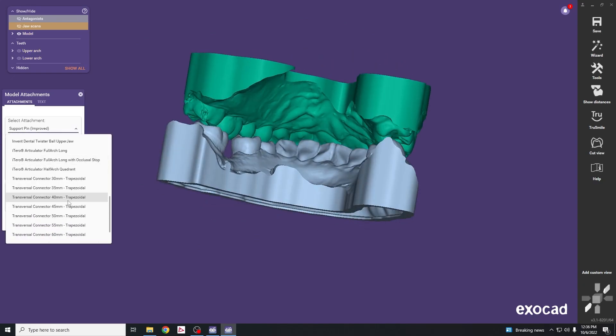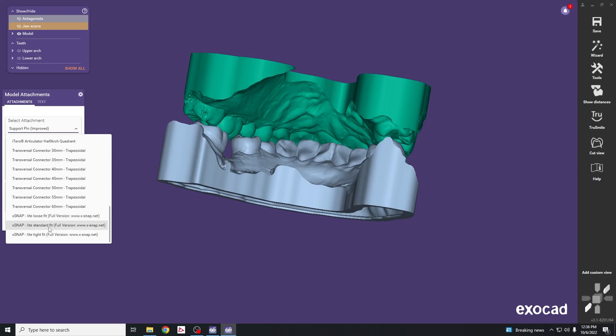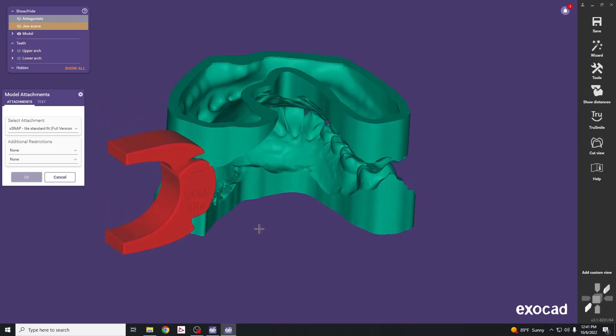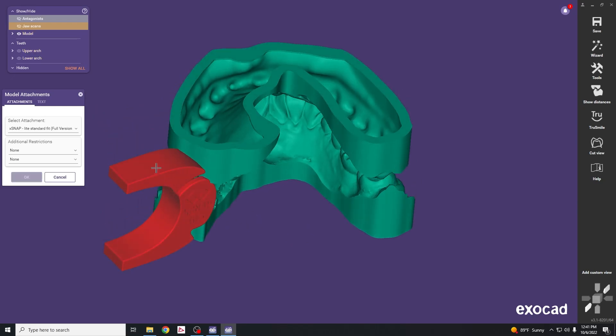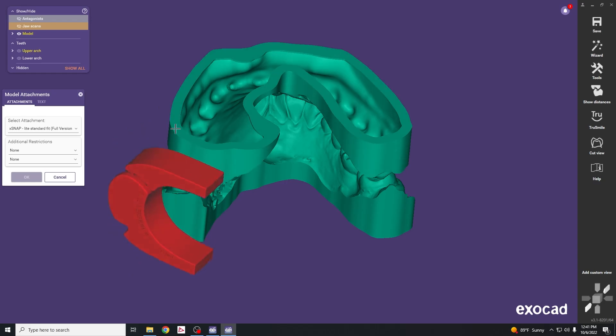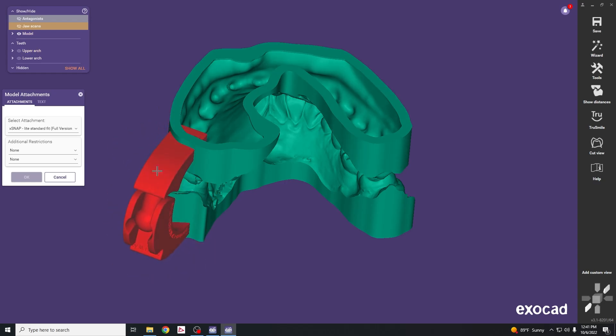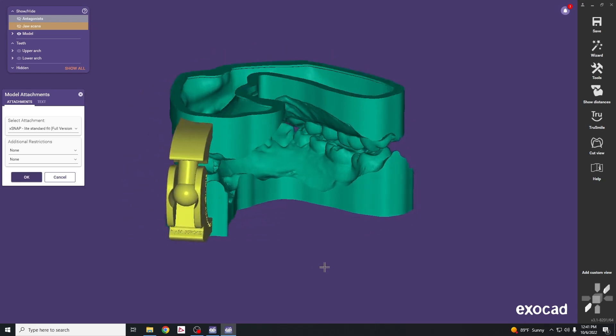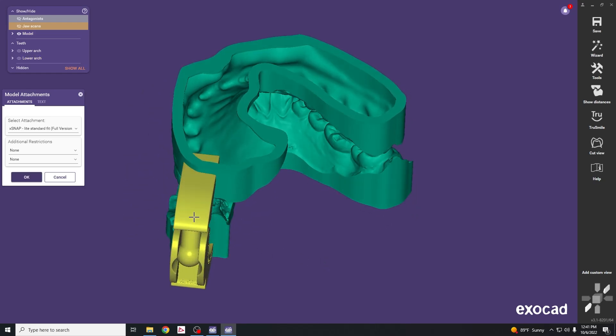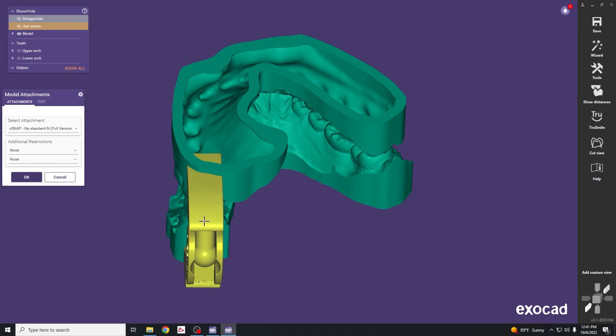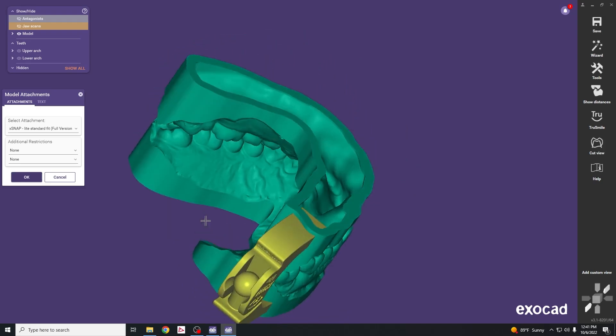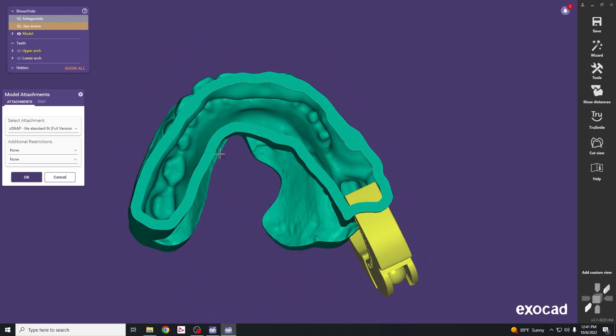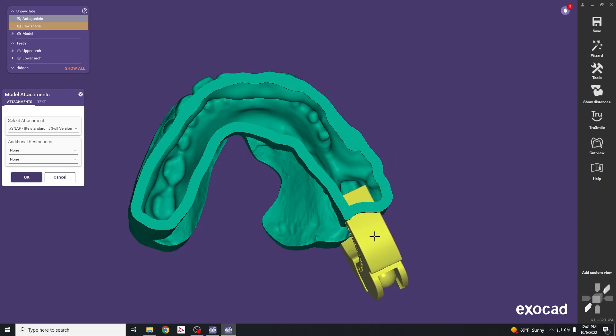The other type of attachment we can add is the X snap feature. Select the standard fit. Click on the posterior area to add the X snap. To rotate it, hit the control button, then click and drag so the extensions line up with the cast. When it's sufficiently overlapped it'll turn from red to yellow, meaning it's in a good position. To move it laterally, just click and drag.